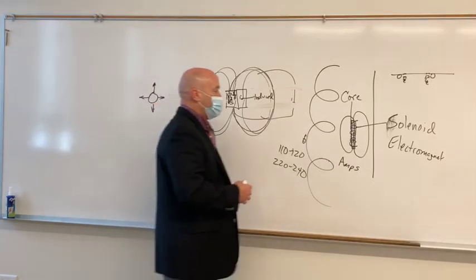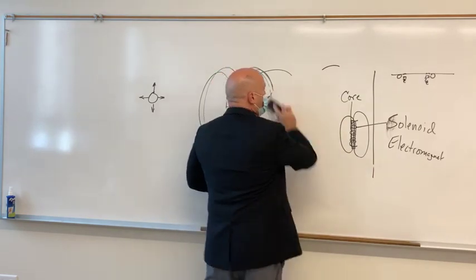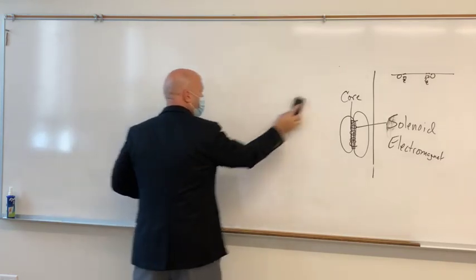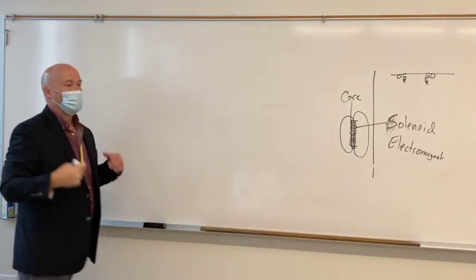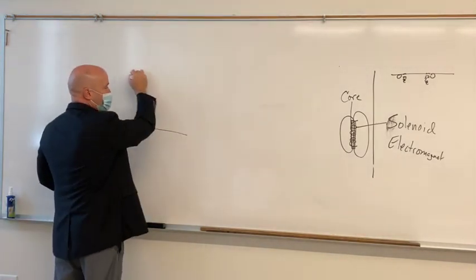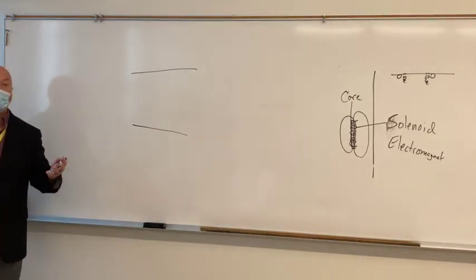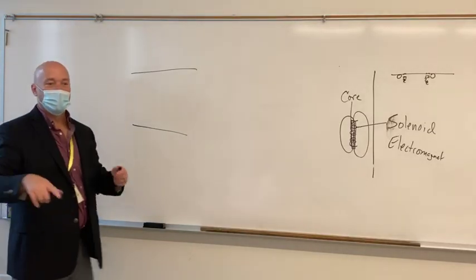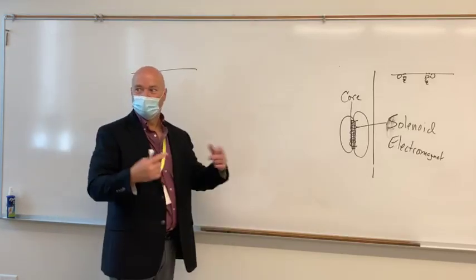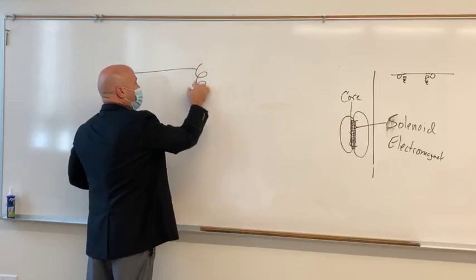Okay? Now, what that also is an illustration of is your autotransformer. So electricity comes into the hospital, it comes into the imaging suite, and the first thing it gets to is your room. Yeah, but in your imaging system, the first thing it hits is, I just said it a second ago, the autotransformer. Well, it's a solenoid, kind of. It's the autotransformer. So you've got the autotransformer.